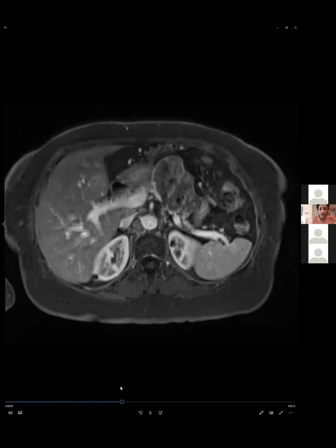Yeah, I have a good colloid PDAC. I'll bring it next time, Alina. But they can be very T2 hyperintense, but usually have much more nodular actual enhancement in them. Okay. This one has all these baby cysts and stuff. Yeah, I think Gaurav had a good point. The MRCP was very helpful for us to show that it really was just a lot of cystic spaces.